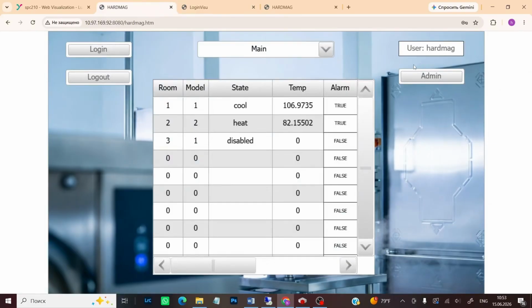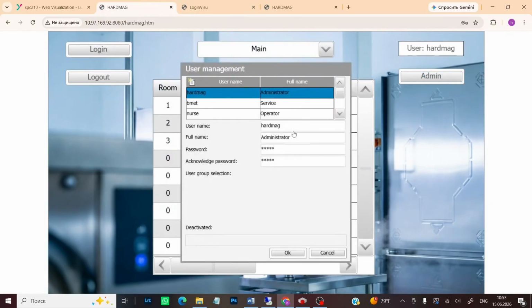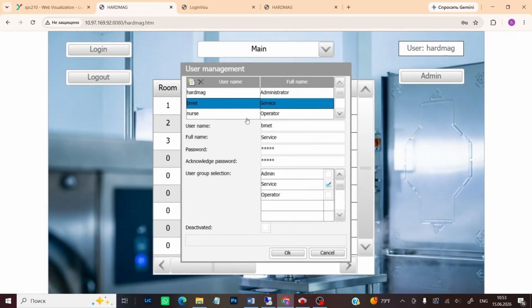Also, when our administrator clicks the Admin button, they can manage users. That means they can delete, add, and deactivate users, as well as assign them different permissions and change their passwords.